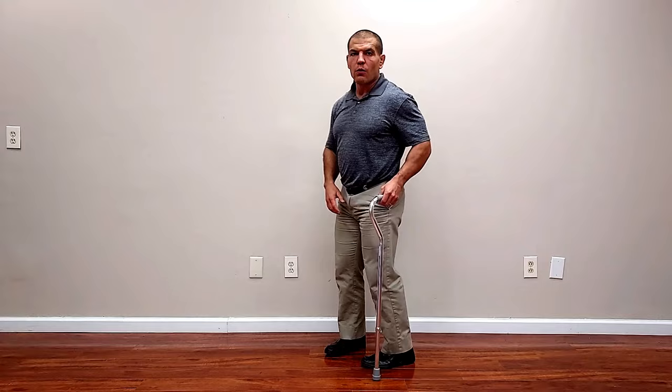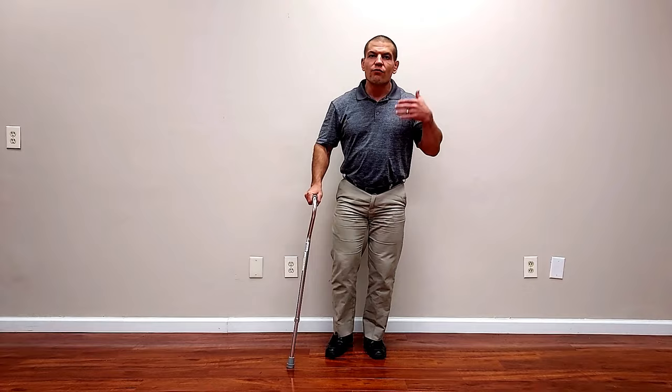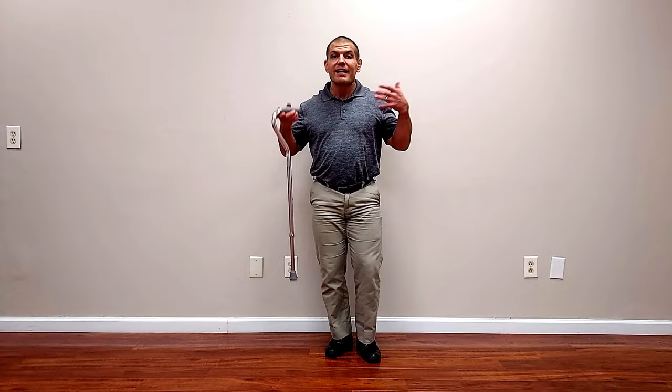Which hand do you use the cane in? You would think you would use it on the side that's hurting so you can lean on it, but really that's not what you do. You actually want to use it in the opposite hand. People also commonly make the mistake of just using it in their dominant hand regardless of which side is bothering them. It does feel a little more comfortable and steady in your dominant hand, but here's the reason why you really want to use it on the opposite side.